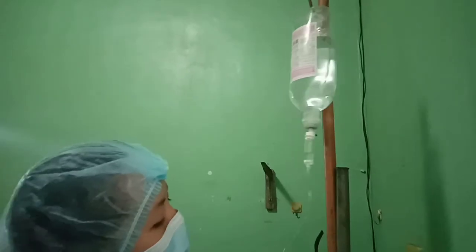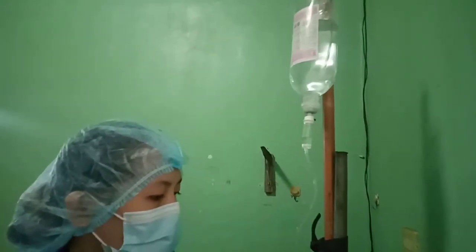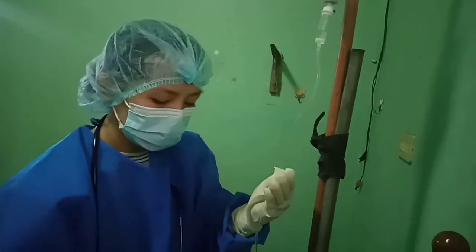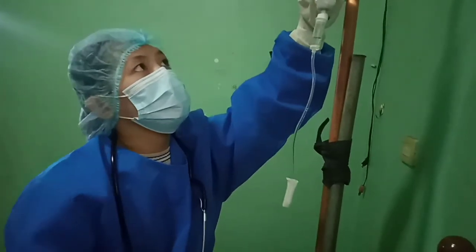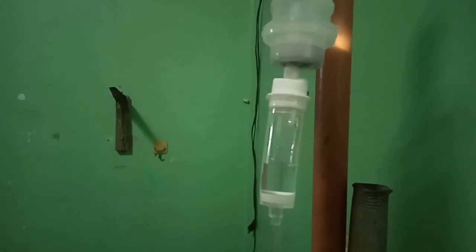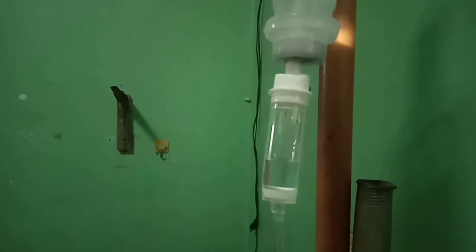Observing ensures that the infusion control device and the alarm are functioning. Lack of knowledge about the alarm may create anxiety for patients. They ensure that the flow rate is correct. Use a watch with a second hand for counting the drops and regulating a gravity-flow IV infusion.